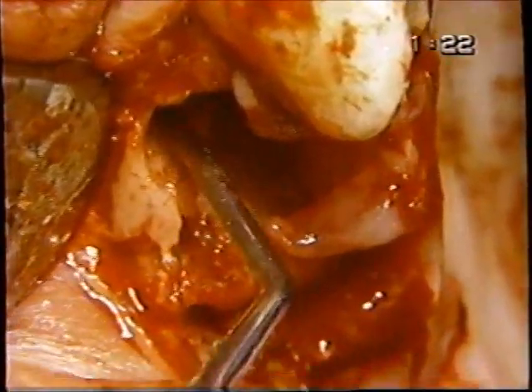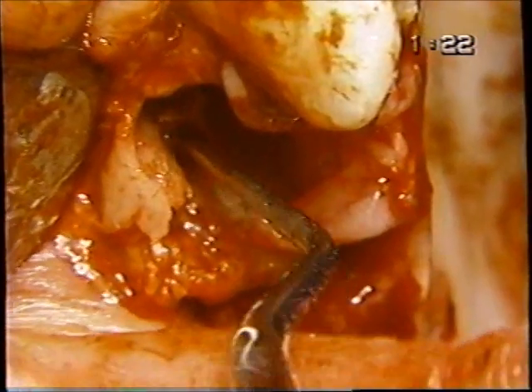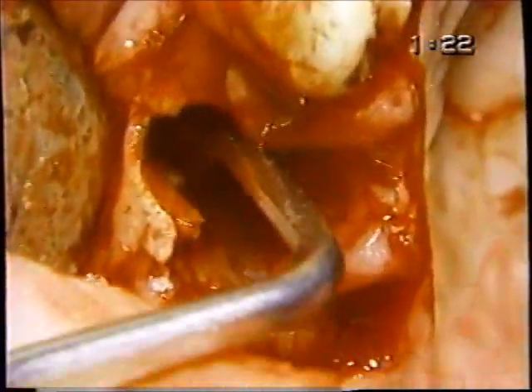So we'll use the root tip pick. Let me just feel down into the other socket first of all. Okay, we know about how far we are, and then I can feel this root right here. And so the first thing to do is to wedge alongside it. I have a feeling that that root is a little bigger than the root tip pick is good for. So let me see the other root tip pick. That's the one. Now if we luxated sufficiently, well, hopefully this would just pop out. But life isn't always that kind. I think we could do this for quite a while and probably wouldn't see very good results.